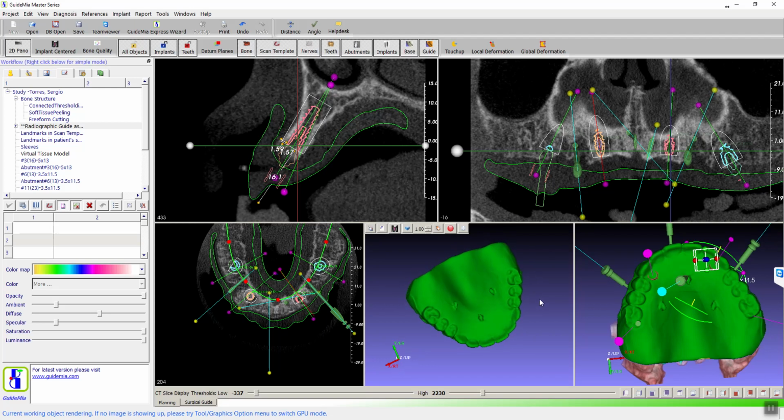Hang on, Craig. Right, we were just having a little sidebar on that because that is a problem very often. The denture, or if they make a duplicate denture, there's no flange coming up the vestibule. And how do we know the depth of the vestibule? If it's not an impression and you don't know, you could be toast. You have to ask the doctor. The only other option is the doctor would have to take the denture, duplicate it, manually extend the flanges, and then take another CT scan. But they're not going to be really open for that.